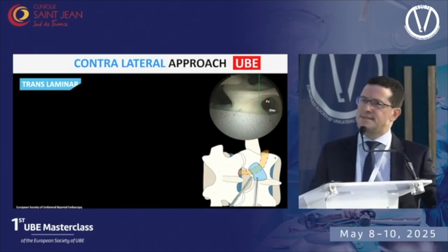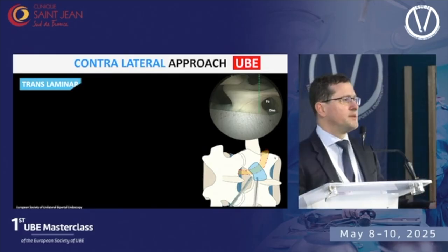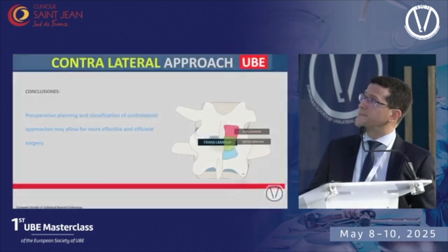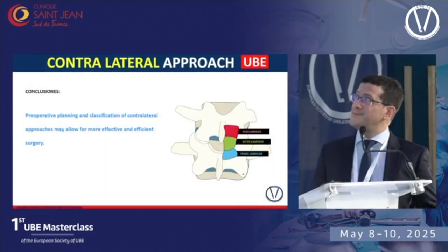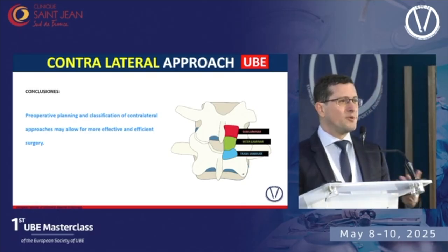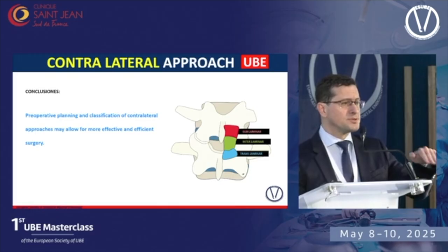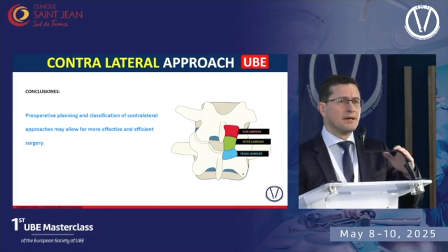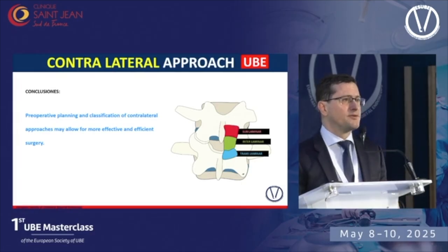So we decompress the level and the adjacent lower level too. So the conclusion is very easy. We need more detail of the nuance of how we undo it, the contralateral approach. We can select a sublaminar, an interlaminar, or a translaminar approach, depending on the patient.